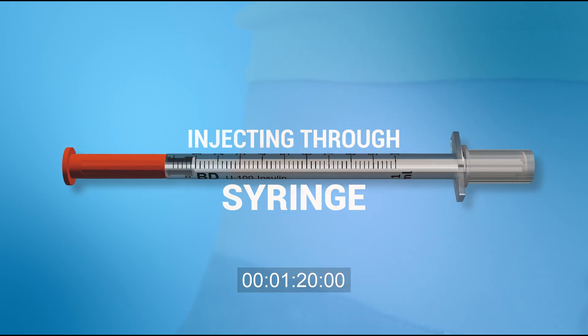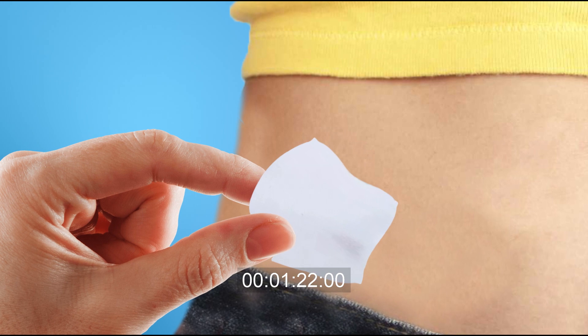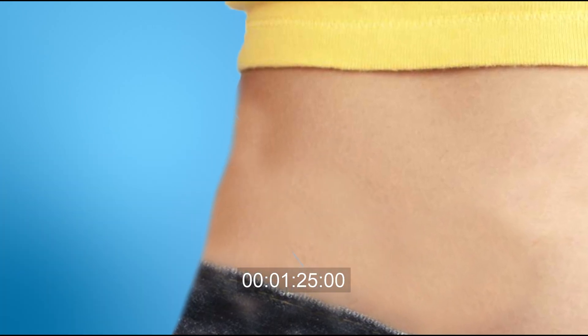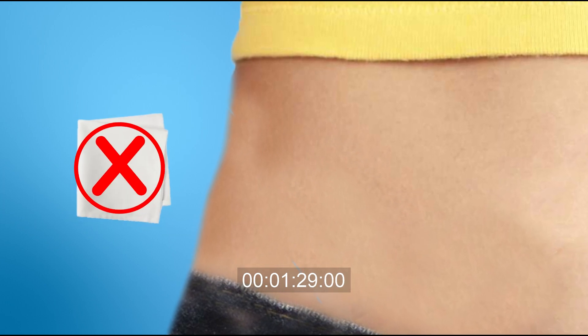Injecting through syringe. Wipe your skin with an alcohol swab. Dry off any excess alcohol on your skin before injecting. Do not inject through clothing.